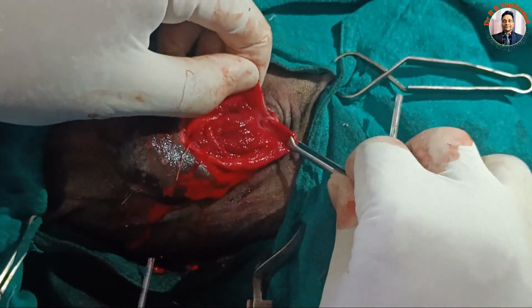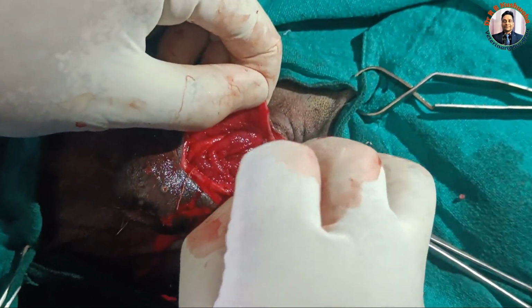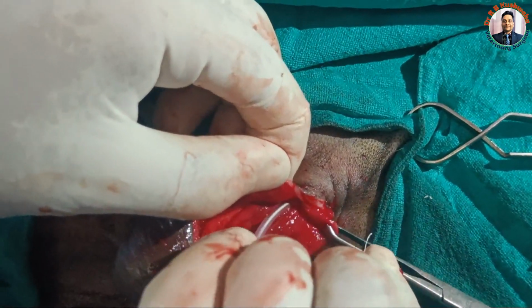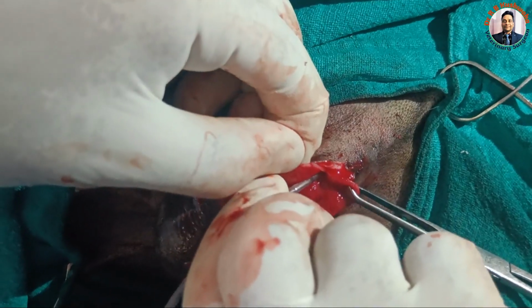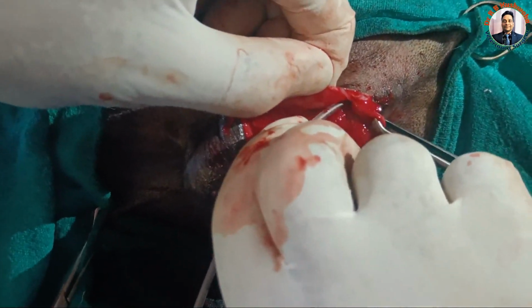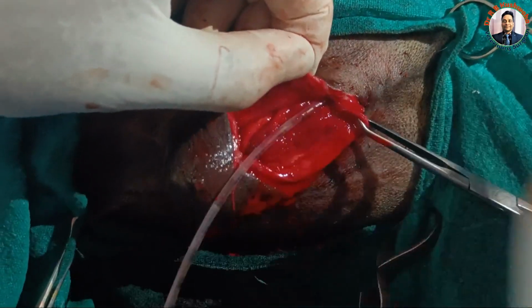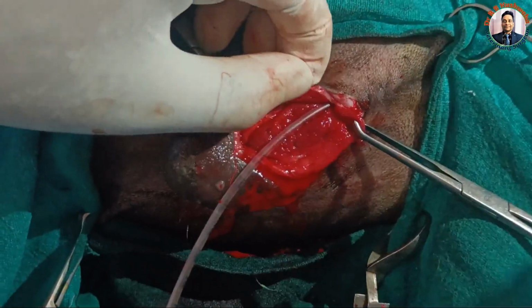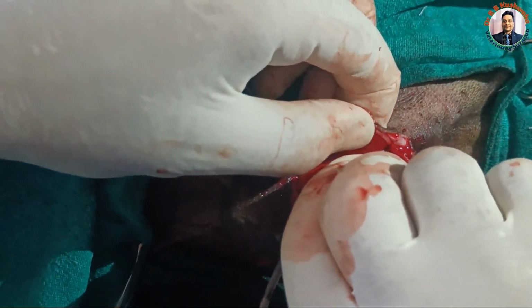Now you could see here, I will try to pass it from here. First, yeah, like this. Now you could see the catheter is going in the urethra. I will pass it gently, as far back as it can pass easily.